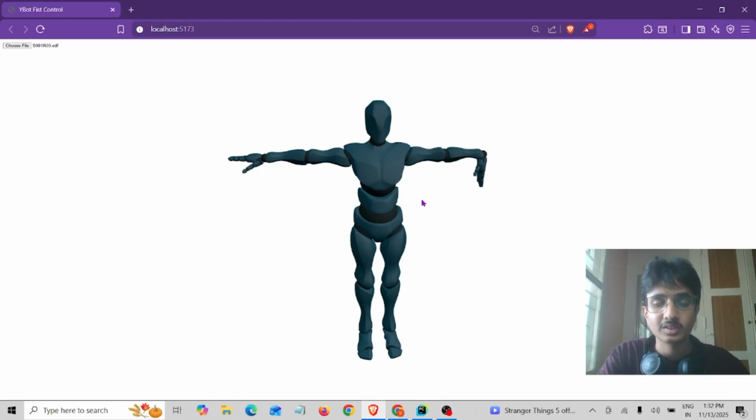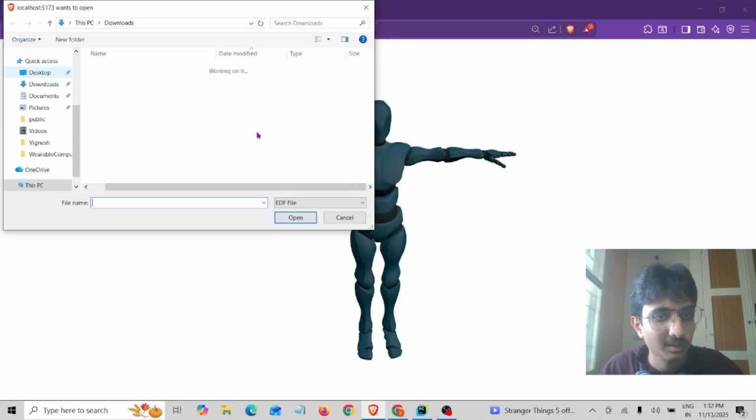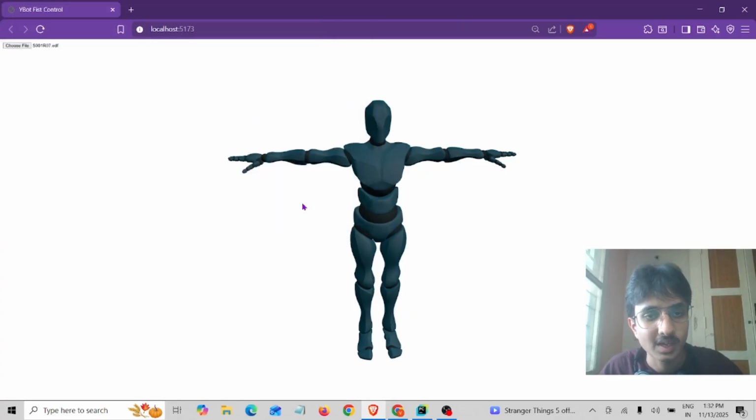As you can see, the left hand of the Y-bot has just bent down and come up. And if we change the file to the right hand imagery, let us see. I have now uploaded the right hand imagery, which after prediction will yield the result. As you can see, the Y-bot is moving its right hand.